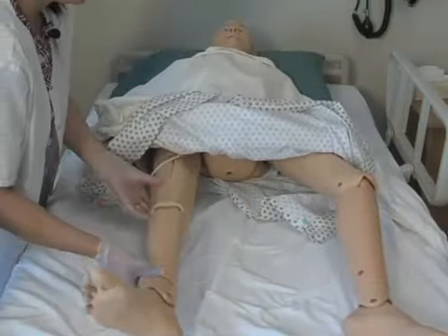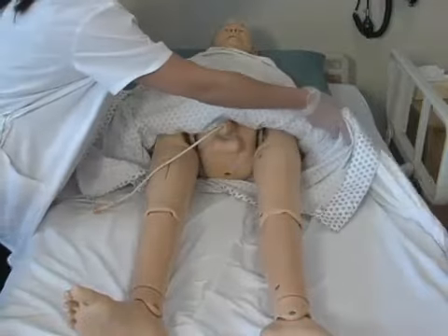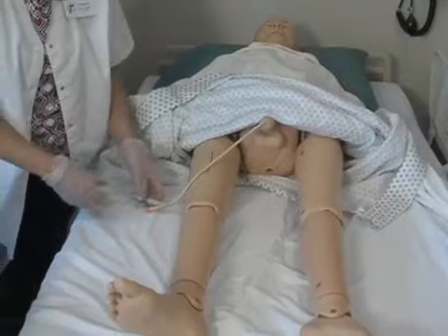And I'm going to bring my patient's legs down, and now I will place the catheter on the proper position.